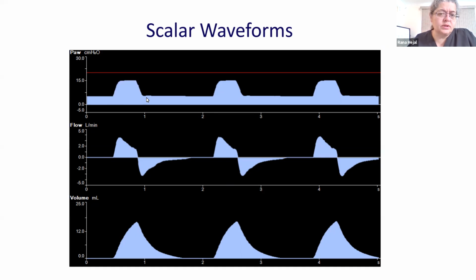this is the correct waveform that you should get on pressure when you are doing volume cycled ventilation. When you are using the decelerating mode, as somebody goes from inspiration to expiration, the flow becomes in the opposite direction. People tend to take a longer time to exhale before their next breath, and during that period of time, a certain volume is delivered. On the pressure waveform, you will be able to see the PEEP, and if somebody's trying to take a breath by themselves or an assisted breath, there will be a negative deflection at the trigger area in this setting.